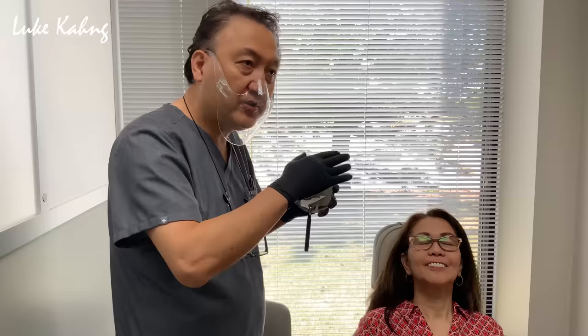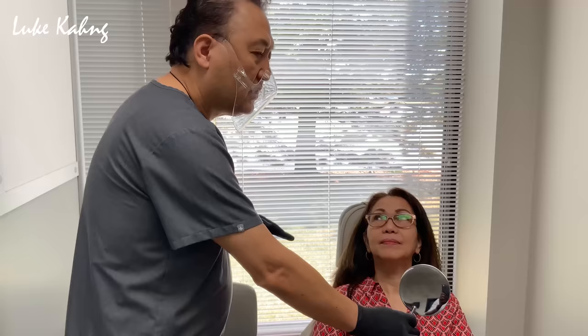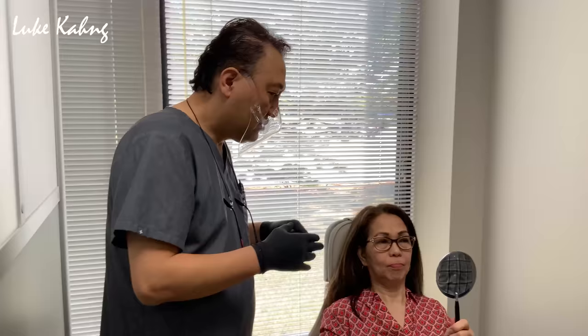Yeah, better? Good. I have her sit a little bit, you know, 10-20 minutes, and then just make sure everything feels comfortable. Anyway, it's Dr. Emilio Carrillo, Chicago patient. He let me cut it, so I just cut a little bit, trimmier there. So have her just relax, and then have her see. And anything, I can take care of it by hand, and then I can give it to her, you know, from no teeth.